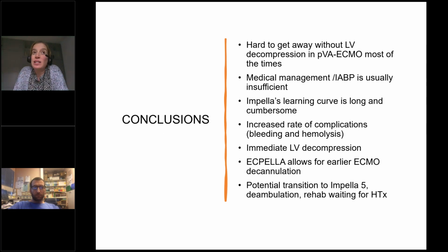We don't do bedside Impella insertion. I personally think that you need fluoroscopy to insert it, and immediate echo on arrival to ITU. And I don't know of other centers doing bedside Impella insertion. We definitely remove them by the bedside, but we don't insert them by the bedside. Do we have a special closing device? Yeah.